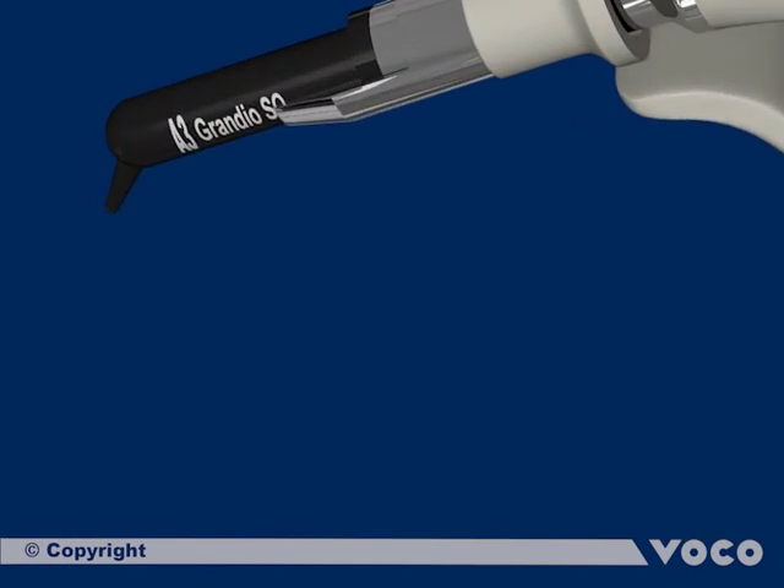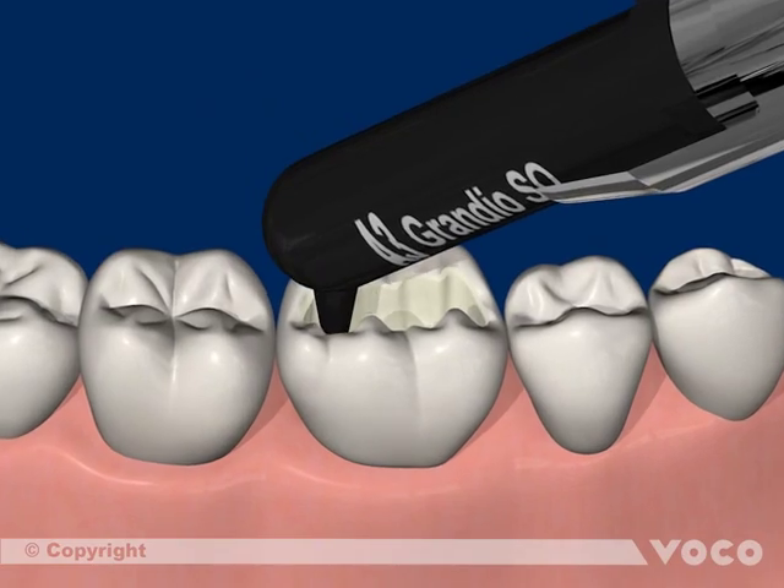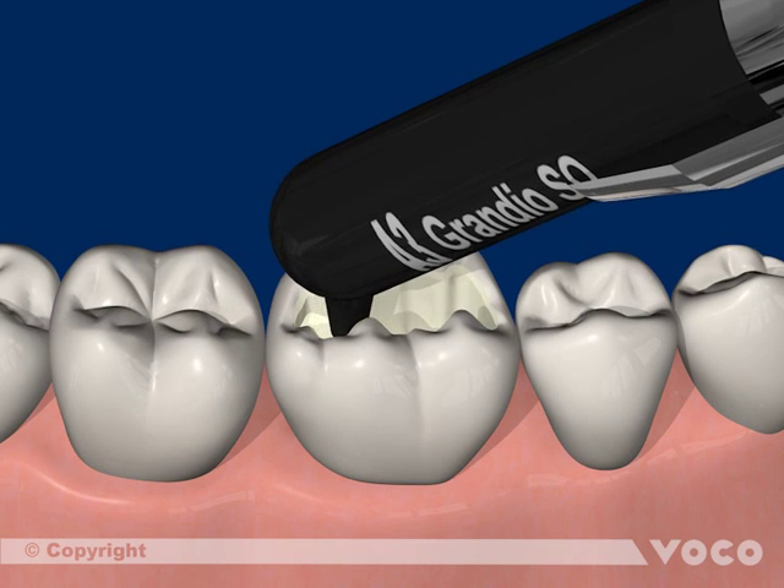The light curing composite Grandio SO is applied in increments and each of them is light cured for 20 seconds.